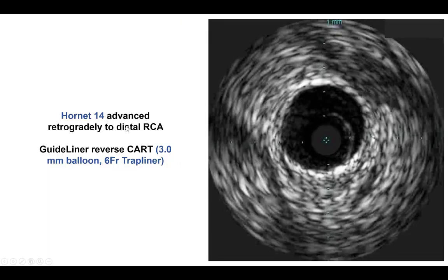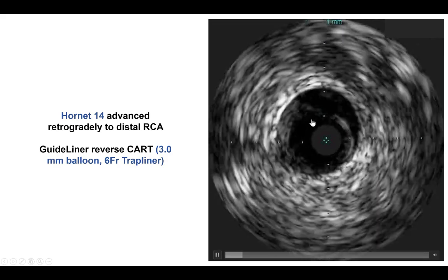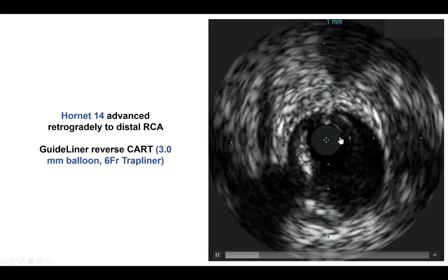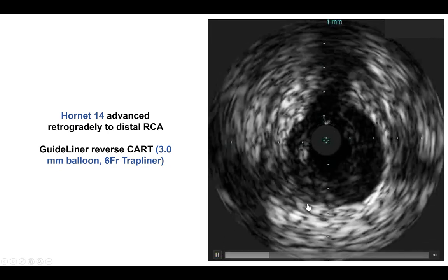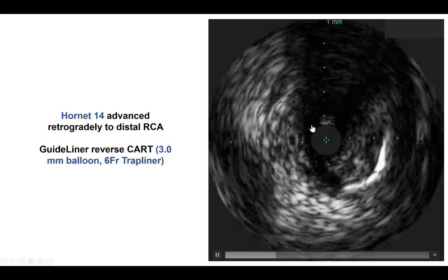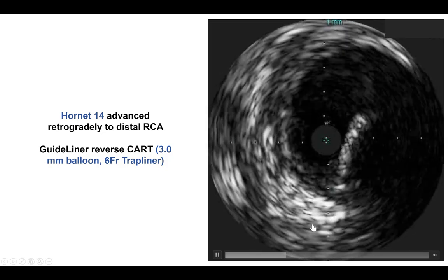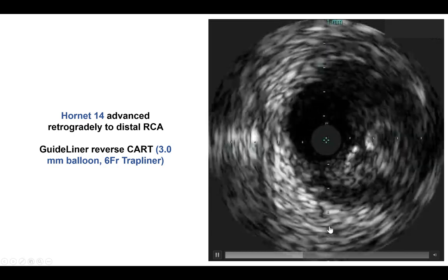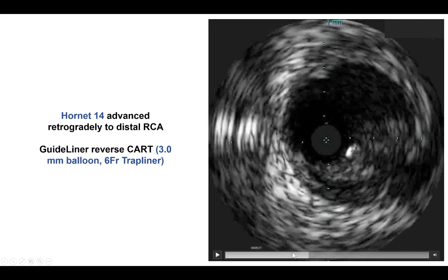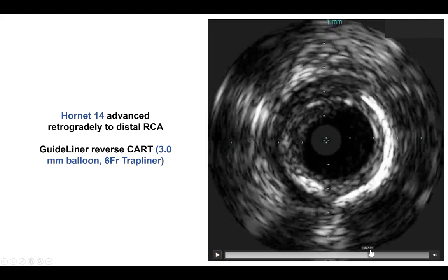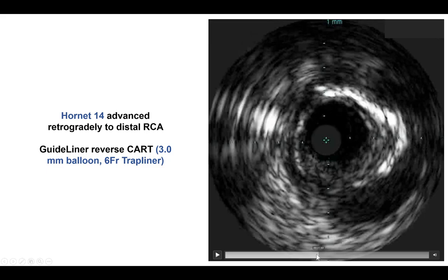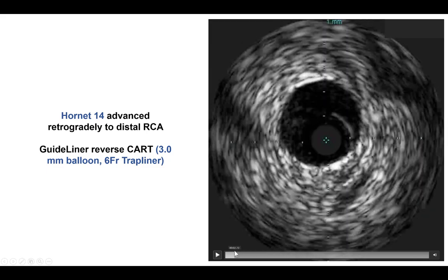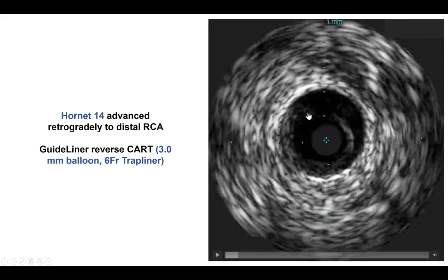After doing that, we were able to advance the retrograde guide wire and externalize it, and we did the intravascular ultrasound that did demonstrate that we were into the distal true lumen. There was a short area of subintimal crossing and then more proximally the wire seemed to enter again into the true lumen. The wire here is in true lumen and as we go further down, the wire does enter into the subintimal space, but very distally it is within the true lumen as well.